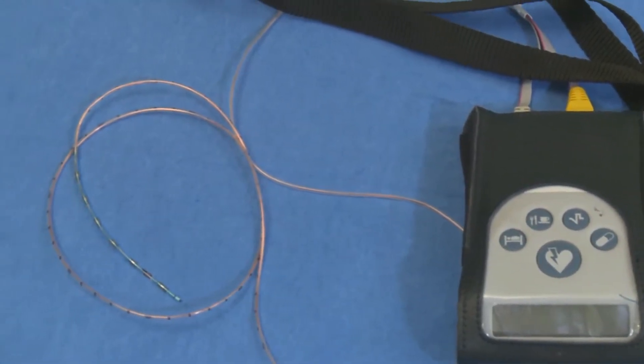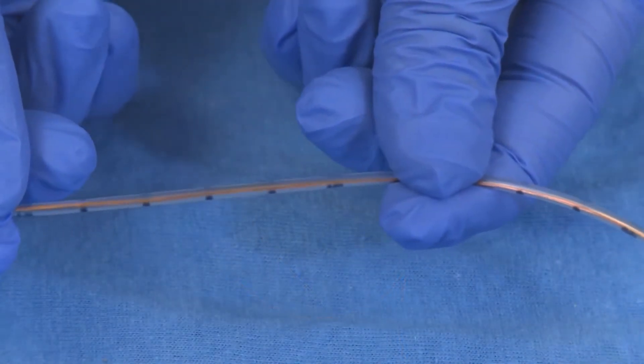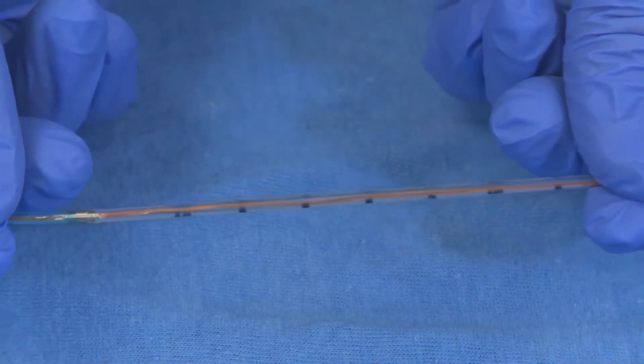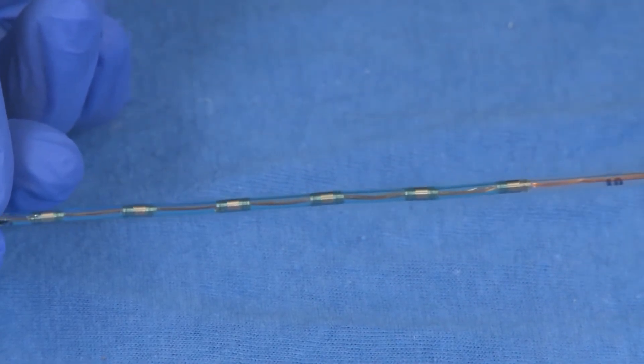Sometimes, after we eat or drink, we can feel uncomfortable. Food or liquid that should stay in our stomach comes back up — this is called reflux. An impedance pH probe measures acid and non-acid reflux in your child's esophagus or food pipe. Sensors along the probe allow us to measure reflux at the bottom, midway up, and at the top of the esophagus. Your physician may have ordered an impedance pH study to see if your child's medications are working to block acid, or to see if your child has acid, food, or liquid coming from the stomach back up into the esophagus.